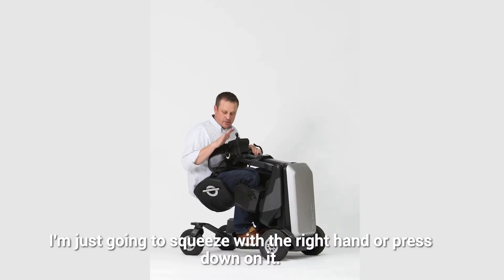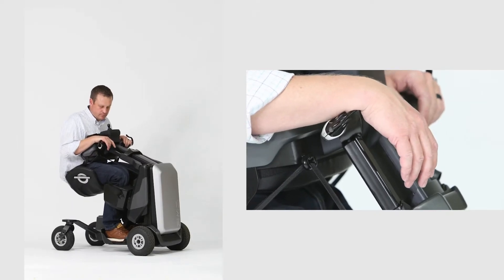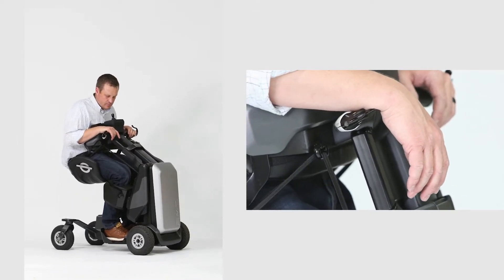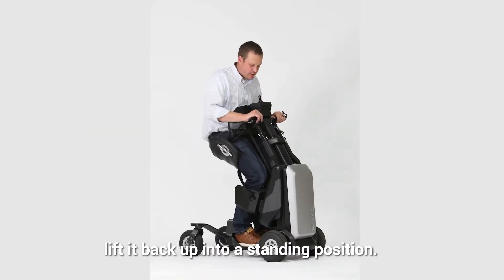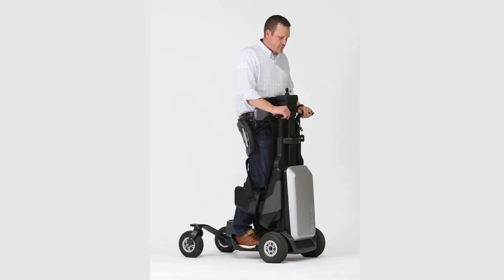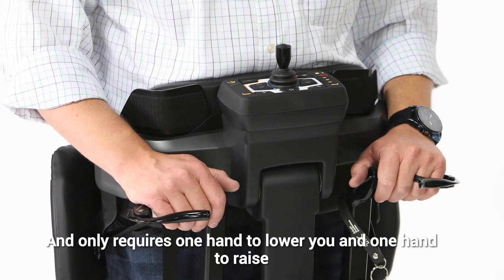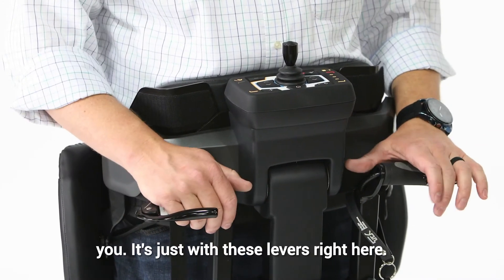Then to get back up, I'm just going to squeeze with the right hand or press down on it, and it'll take care of 100% of my body weight to lift me back up into the standing position. It only requires one hand to lower you and one hand to raise you with these levers.